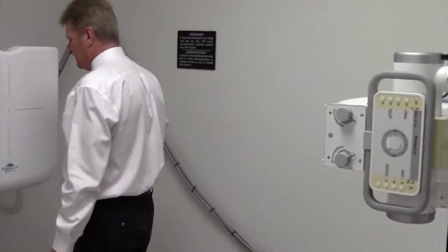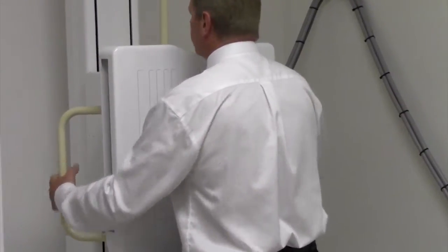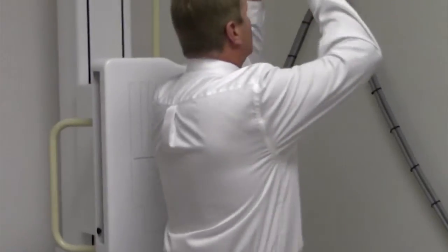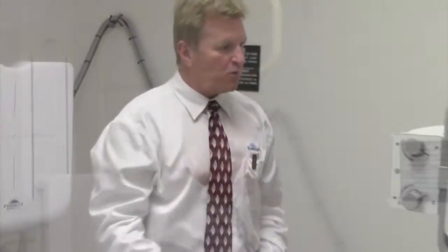For chest x-rays, the wall stand includes patient assist bars on each side for security, for the stabilization for the patient, for the PA view, as well as a bar to hold onto for lateral chest x-rays.